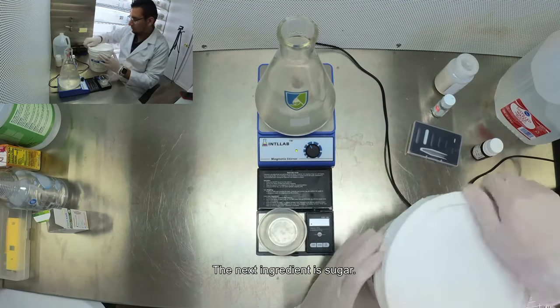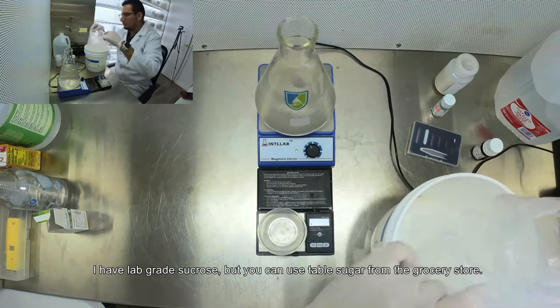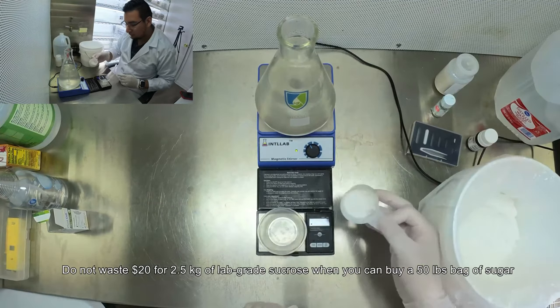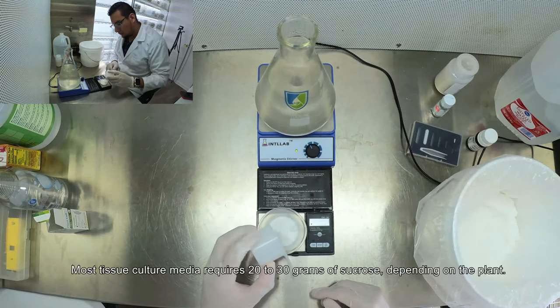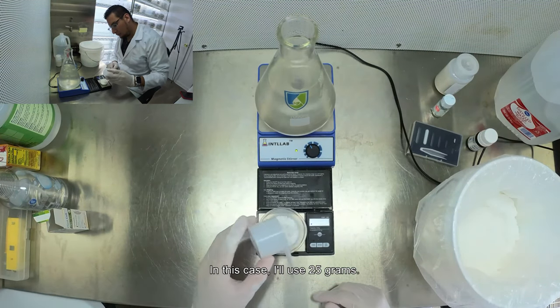The next ingredient is sugar. I have lab grade sucrose but you can use table sugar from the grocery store. Do not waste $20 on two and a half kilograms of lab grade sucrose when you can buy a 50-pound bag of sugar for less than that. Most tissue culture media requires 20 to 30 grams of sucrose depending on the plant — in this case I will use 25 grams.